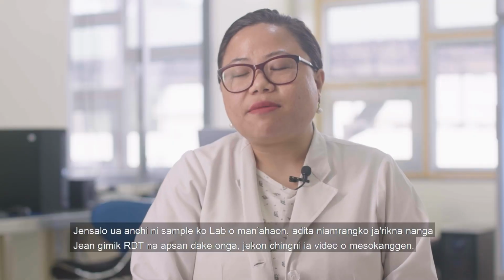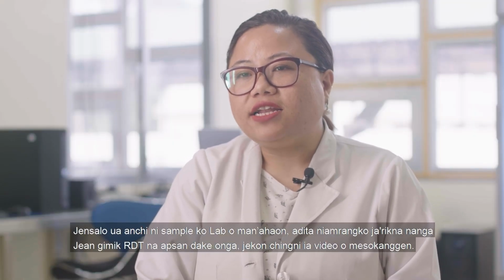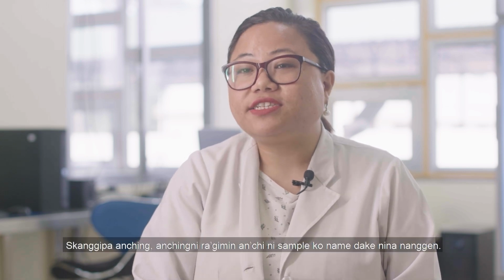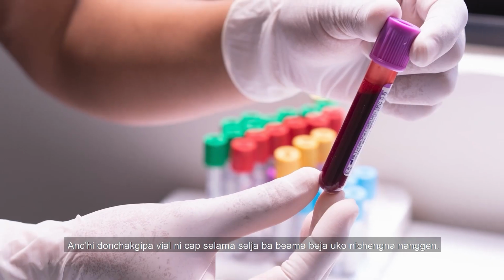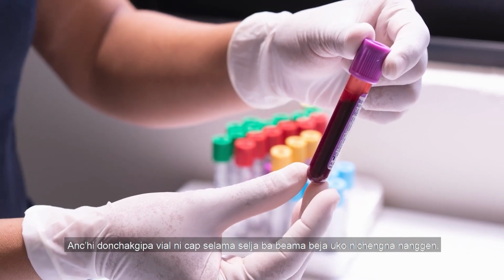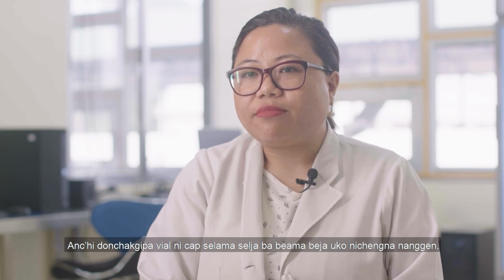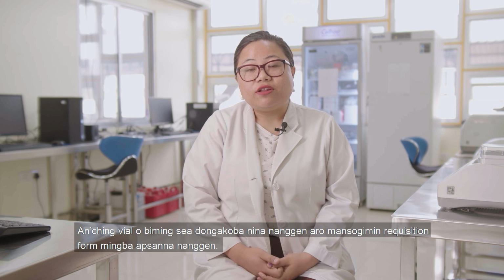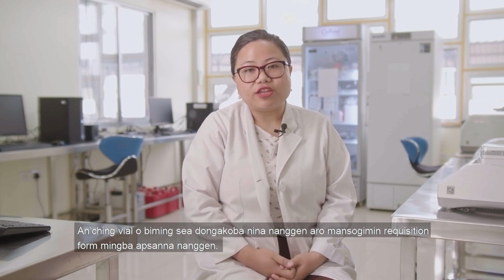Once you receive the sample in the lab, there are certain steps which are common to all of the RDTs that we are going to be showing in the tutorial today. The first step is you have to check the integrity of the sample. First of all, look for any kind of leakage or any break in the vial or any break in the cap of the vial. You're going to look at the labeling of the vial as well, so that it matches the requisition form that you receive.